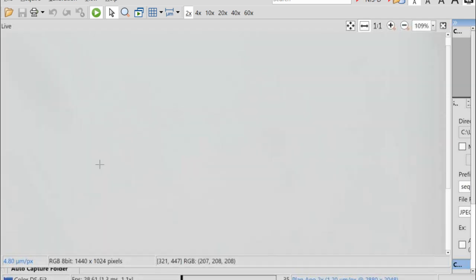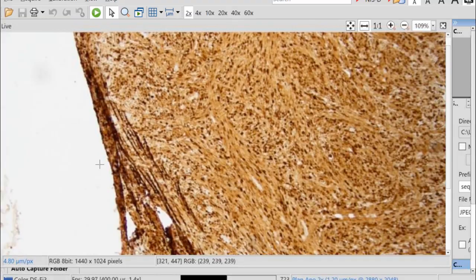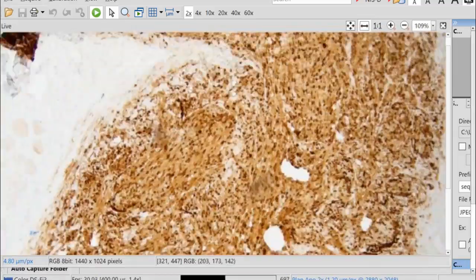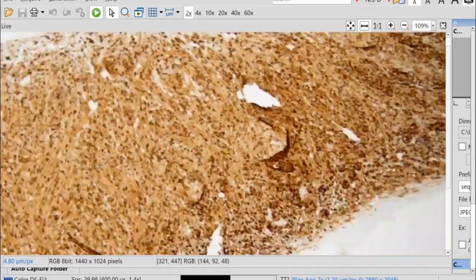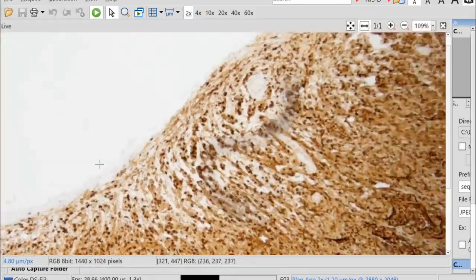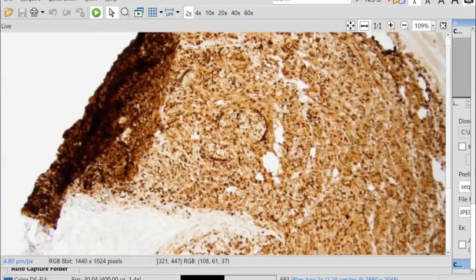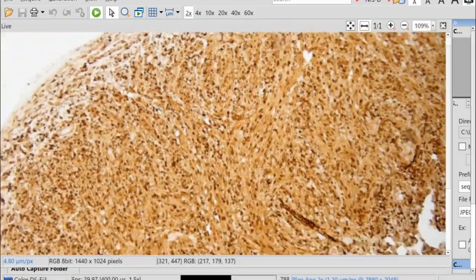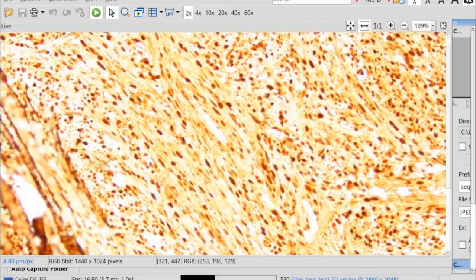First, here you have S100, very strong, uniformly strong. So well-differentiated Schwann cell neoplasms, without exception really, have strong S100 that is nuclear and cytoplasmic. If you are considering a schwannoma or some sort of Schwann tumor and it is negative for S100, most likely you either have technical problems with your immunostaining or you're wrong, really. So it's something that must give you pause when you have something that is negative. Here, very strong, uniform S100 positivity in these cells.